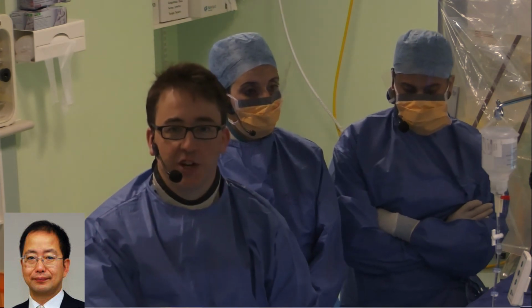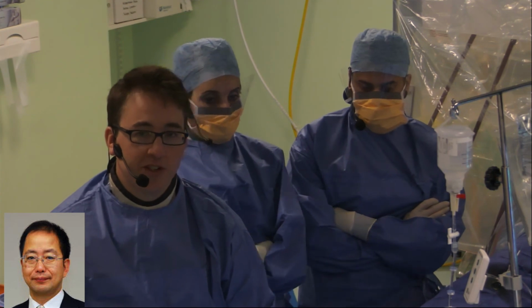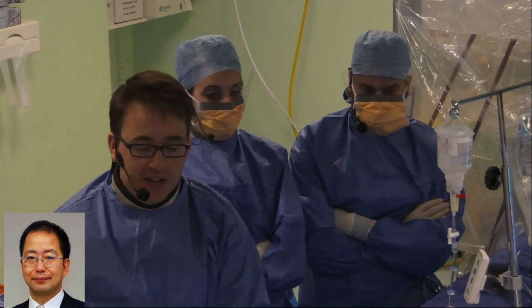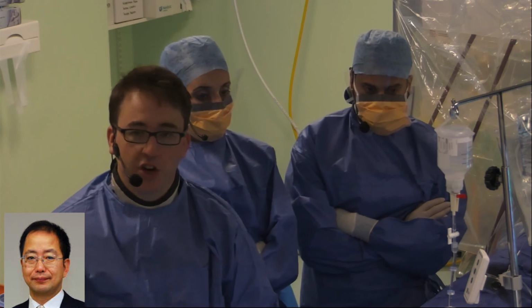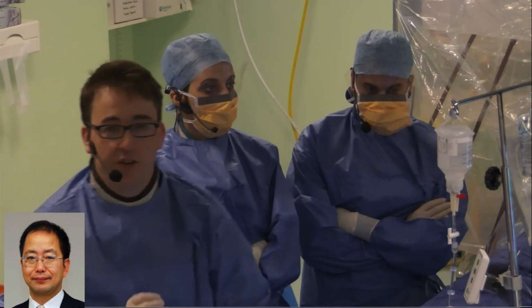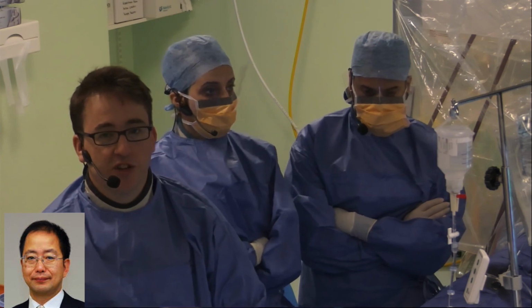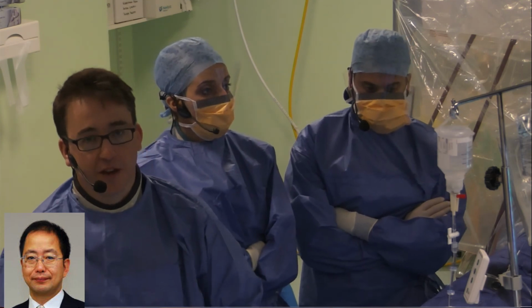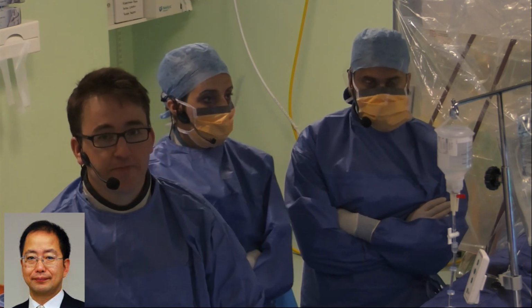Very occasionally you'd have a problem with a wire which was not working as well as it should. If you have a problem normalizing, then that's an issue where the wire potentially needs to be replaced. If that's not the case, in almost all cases you can normalize the first time you go down and there's generally not a problem. So I think there's two things. One is making sure you can normalize the wire, and usually that happens pretty slickly. The other is to make sure at the end of the case that there's no significant pressure wire drift, and to recheck. Both are very, very important, and they're both important for both iFR and FFR.